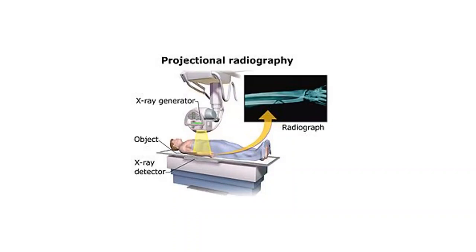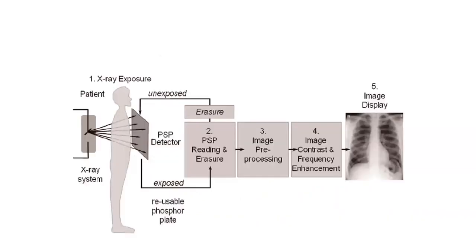And the way chemical film used to work is that when it was exposed to X-rays, it turned black. The film was white and it turned black. But where the X-rays bounced off, you got a shadow, and that was the white, okay? So the calcium in your bones, the crystalline lattice in your bones, depending on the density, would scatter it to a certain degree, and so that's how you got a negative image effectively of the limb. Make sense? Anybody do photography? So now it's digital photography, but this is how chemical photography used to work.